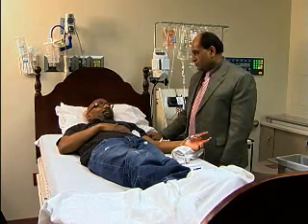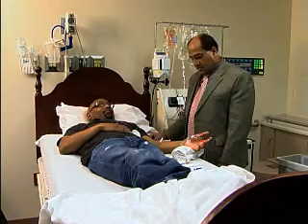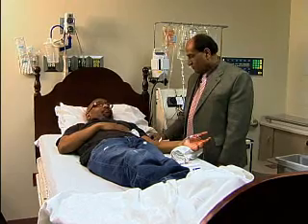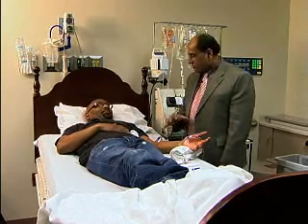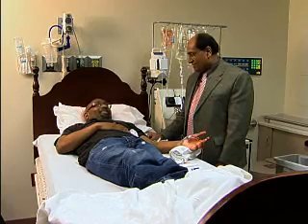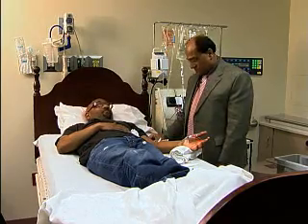And every time we do a treatment, we use the arterial line? Yes. And it's the same one? Yes, same one. Okay. And so we have done it 100 times and no problems? No problems. Was it painful? No. Good. And after the treatment, we take it out and put some pressure, and you go home and drive and everything? Drive. You go back to work? Yes. Play drums, play sports. And it doesn't bother you, the site? No. Okay, good.